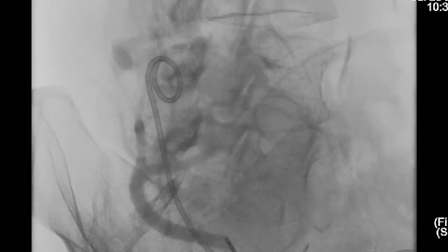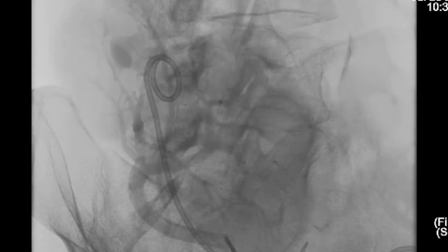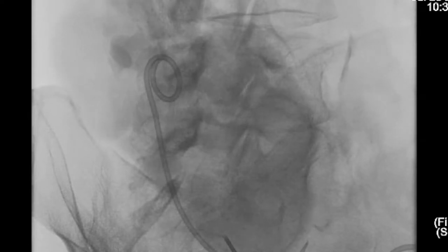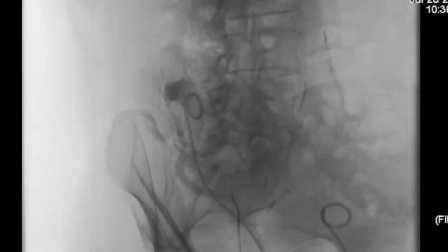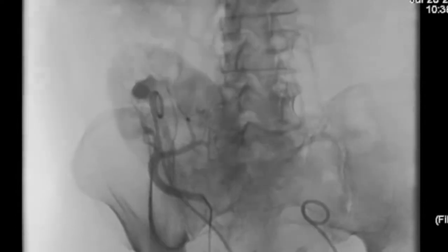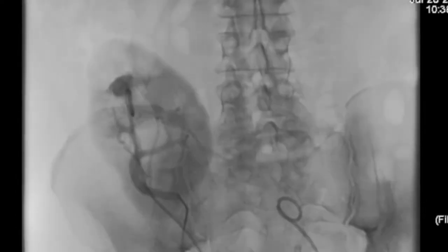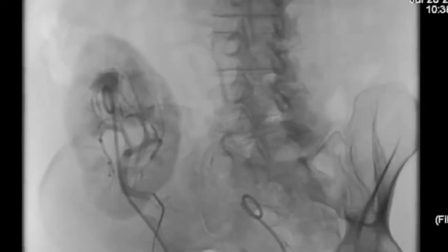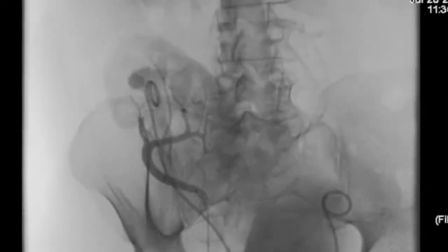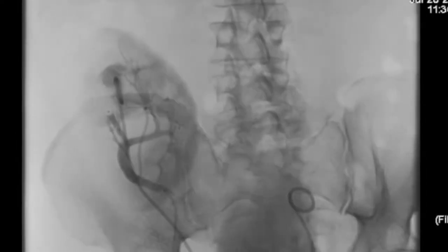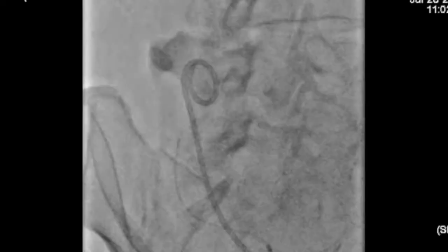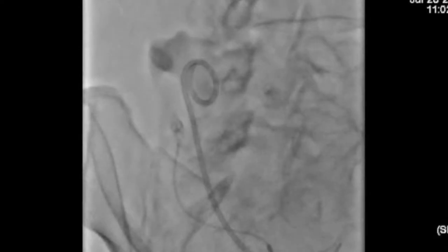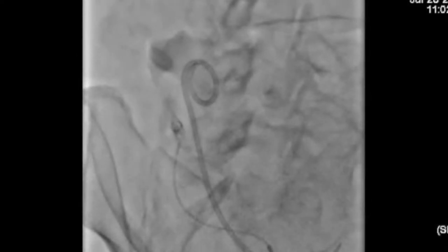The first step of the procedure is the IR balloon placement, done after a complete arteriography showing the whole vascularization of the kidney graft. We can clearly see the hypervascularization of the kidney tumor, located just above the superior part of the double J stent. A 4 mm diameter occlusive balloon is placed on the lower part of the segmentary artery vascularizing the kidney tumor.